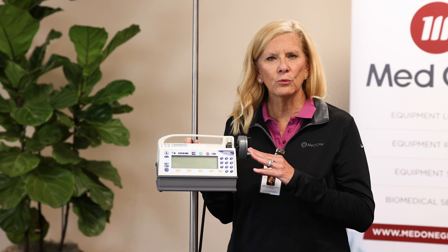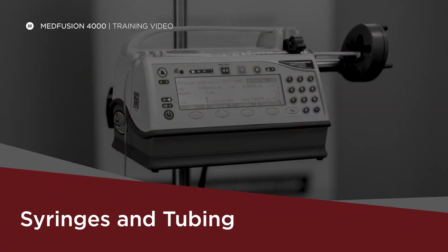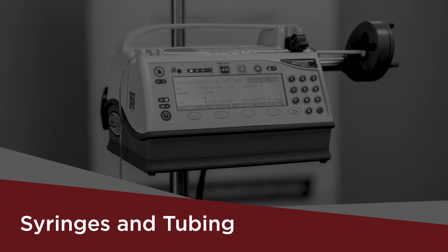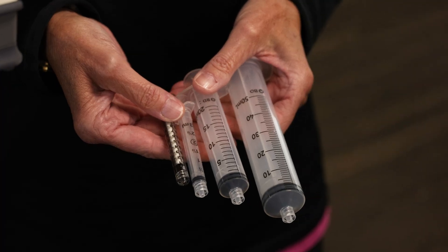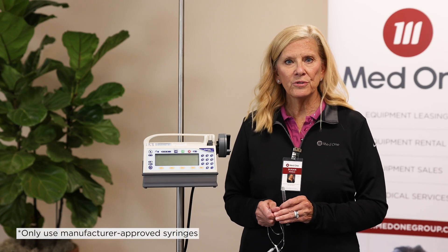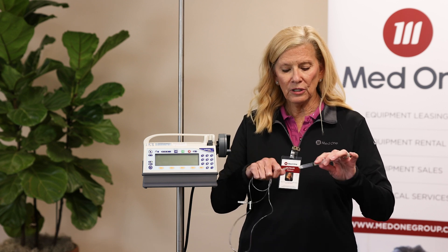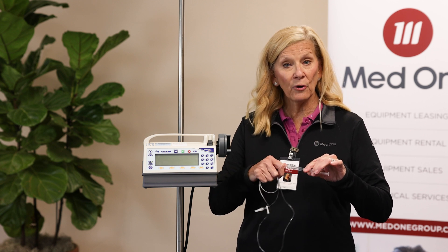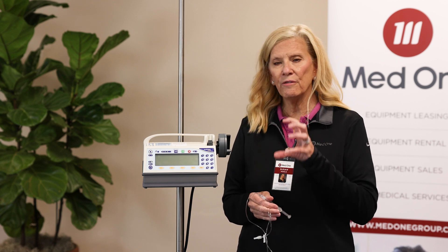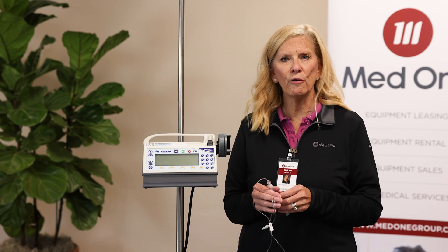Next, we're going to talk a little bit about the syringes, the tubing, and then go into some programming. The MedFusion 4000 accepts anywhere from a 1 up to a 60 ml syringe, from multiple manufacturers like BD, Terumo, Monoject, and B. Braun. You can use any extension tubing — just luer-lock it to the end of your syringe and do not prime it yet. We recommend priming on the device, as it helps the motor get started, reducing any mechanical slack that may happen, especially for low flow rates.